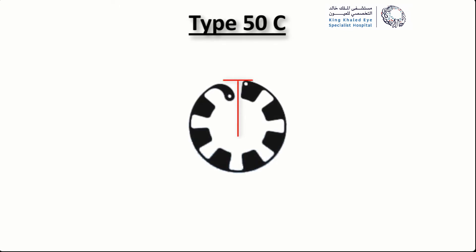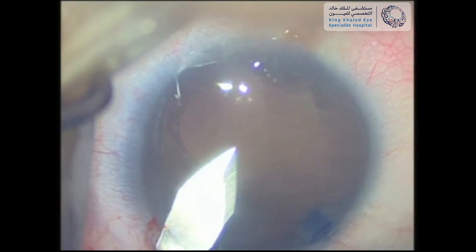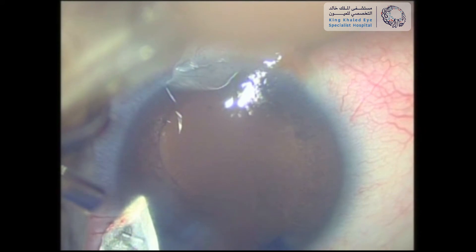The implant that we used was type 50C, which has a size of 10 mm compressed and an inner diameter of 6 mm. The manufacturer recommends a 2 mm incision, but we enlarged the wound a little bit for better control during insertion.